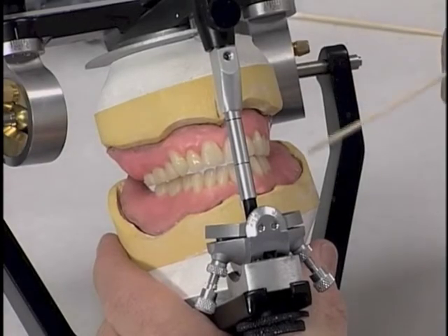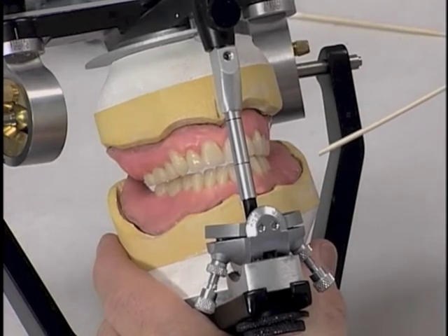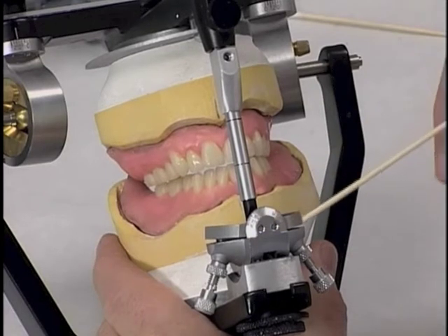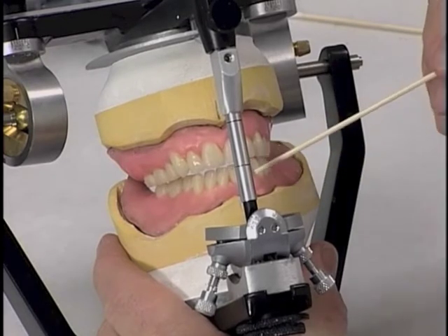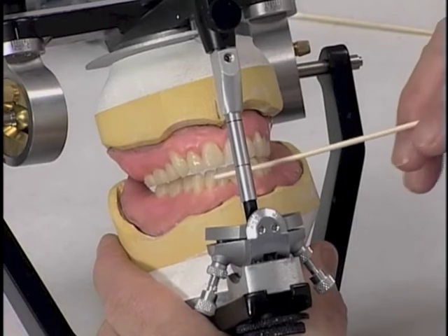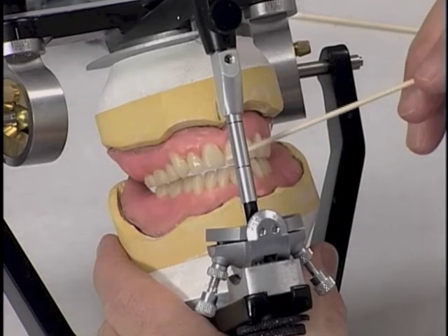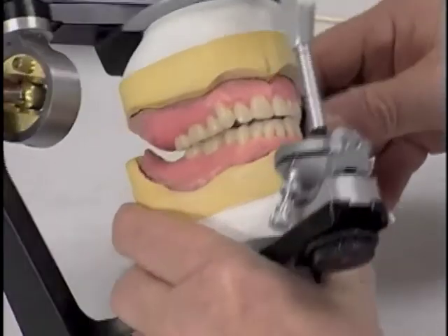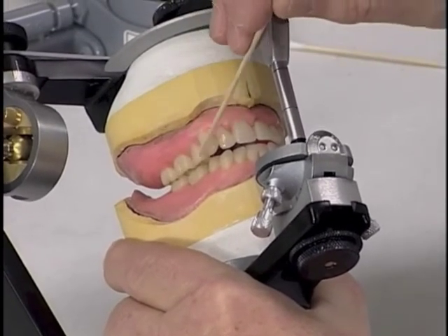We now have all of the teeth for this arrangement arranged and in the occlusion that we would like it to be. Notice for non-anatomical occlusion or flat plane occlusion, we've kept the incisal guidance at a very, very shallow 5 degrees or even less of incline. And that leaves us almost just an end-to-end, or as far as vertical overlap is concerned, virtually no vertical overlap of these anterior teeth. We also want to notice that in an arrangement of the posterior teeth, we have provided in here about 2 millimeters of horizontal overlap.